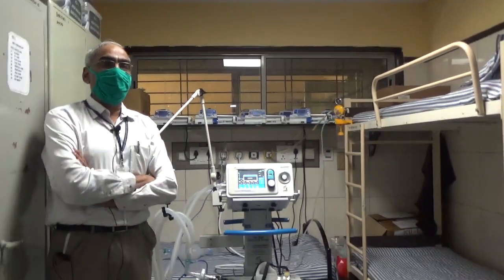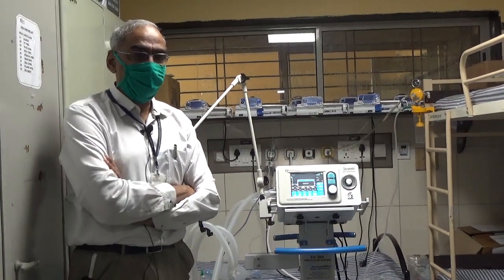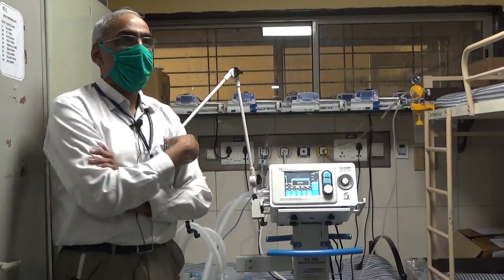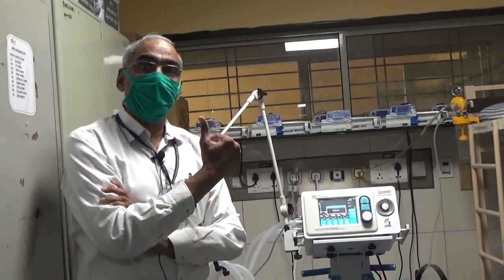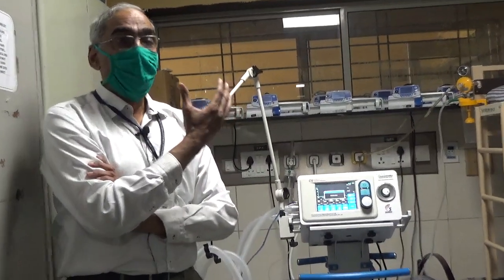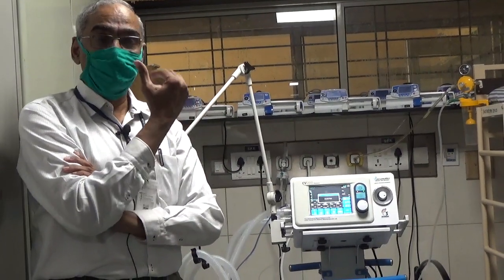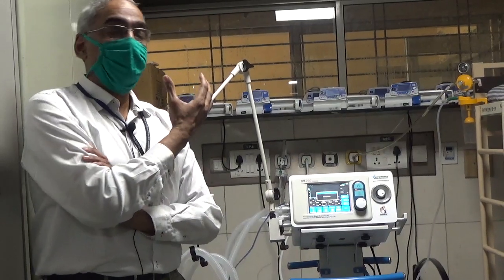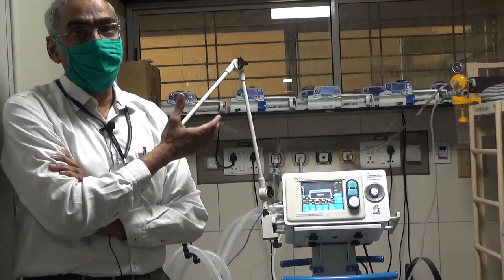Okay, so I hope you've understood how the mask is attached, how the ventilator is set for non-invasive. Now, once you start the ventilator on 5 and 5, if the patient says that I'm getting less air, then you can increase the pressure support of 5 to 10. You can look at the blood gas half an hour later. If you find that the PCO2 is going up, you can increase the pressure support. You can then increase the backup rate which is set. You can increase it to 20 if you require.